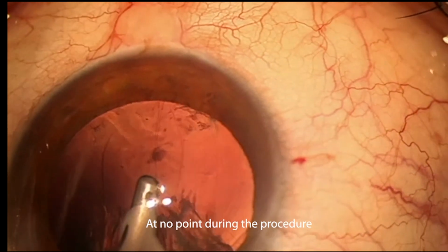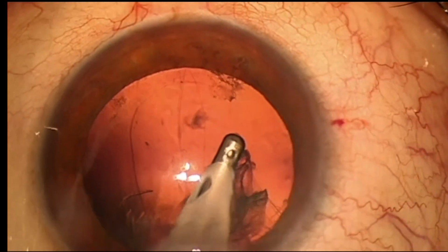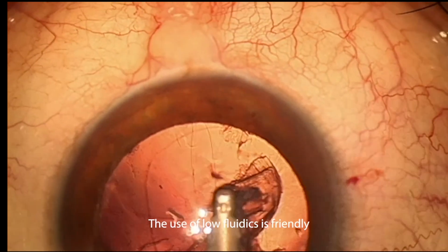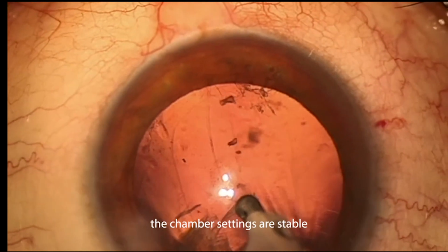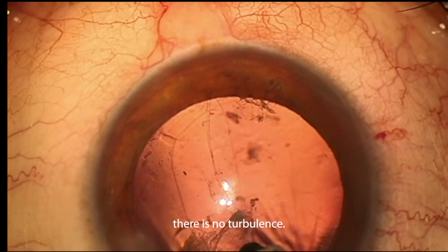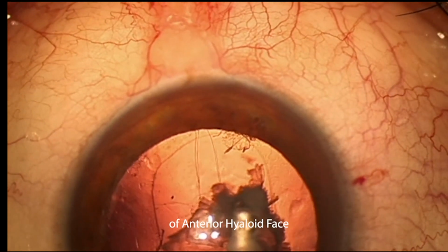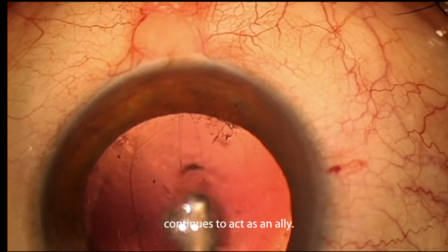At no point during the procedure does the fluttering cease, indicating that the AHF has remained consistently intact. The use of low fluidics is friendly to the anterior hyaloid face. The chamber settings are stable and there is no turbulence, which can be hazardous to the integrity of the anterior hyaloid face. The AHF continues to act as an ally.